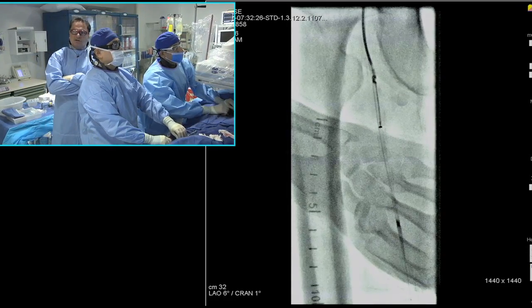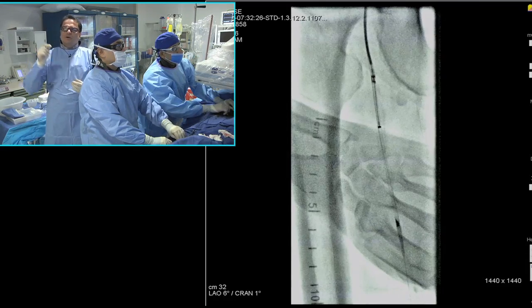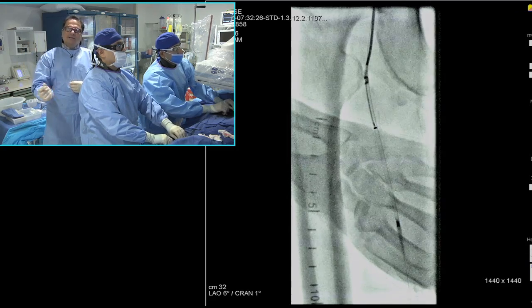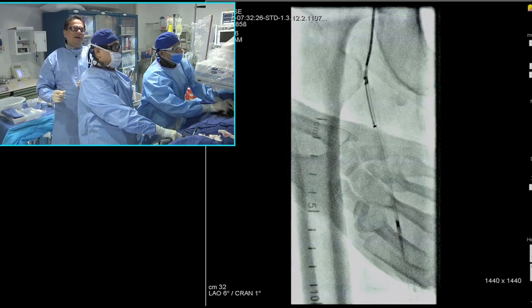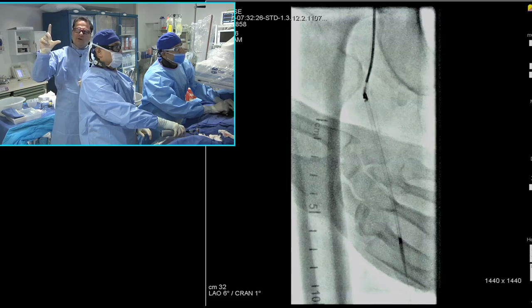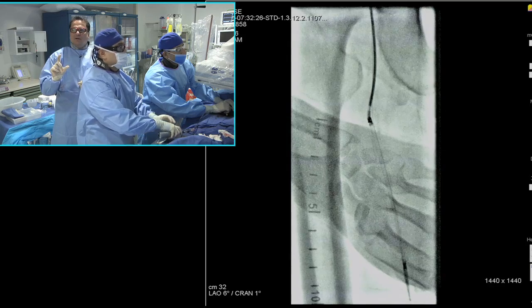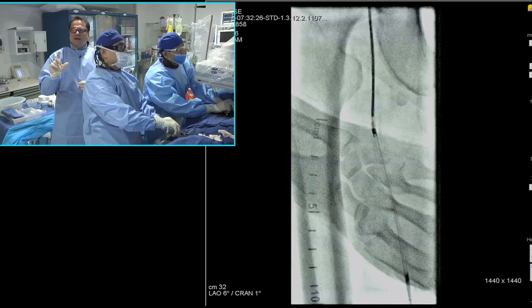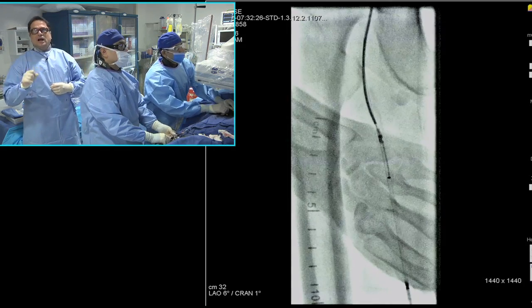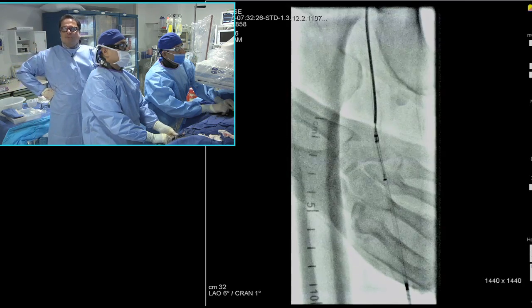Whether you have a case like ours where the thrombus is highly suspected, or maybe where you get through an occlusion, which is very difficult, and then as you push through, suddenly it becomes very easy, and then you hit another occlusion. What's probably happened there is you've got an area of stenosis and occlusion, a hibernating section probably fed by a collateral with clot, and then another area which is now occluded, and then a patent area. So that segment in the middle is where you're going to have your thrombus. And once you get through, you balloon it, and everything goes downstream, and now you're in a 4.5-hour case.